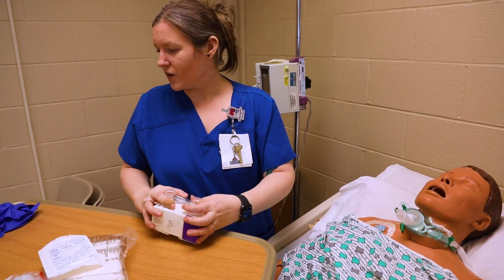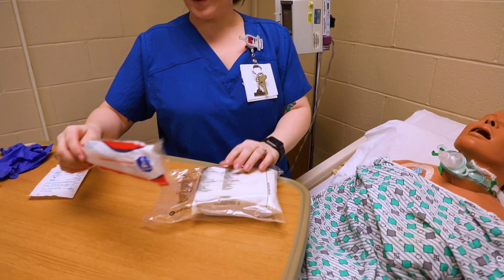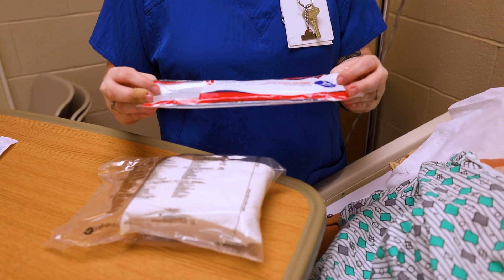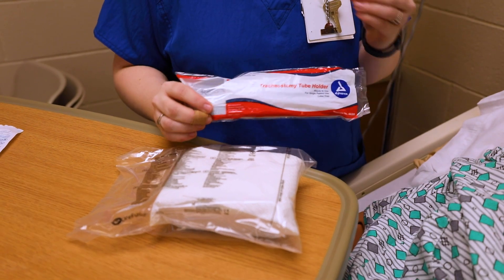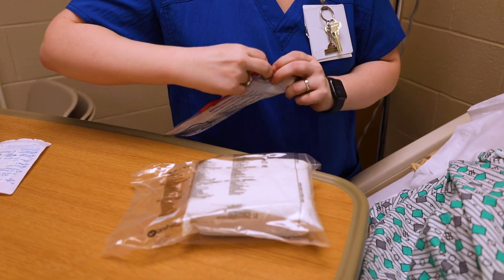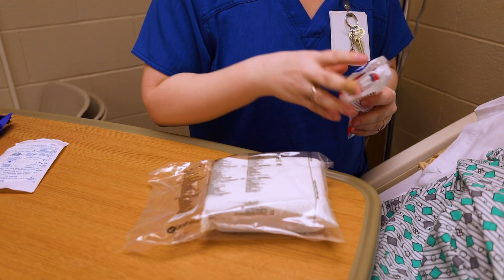I've got my trach care kit, and I also have this trach tube holder. I prefer this one because it has velcro versus the ones that tie — the ones that tie tend to get harder to take apart. I'm going to go ahead and open this. Make sure your area is nice and clean, and note that this is sterile.